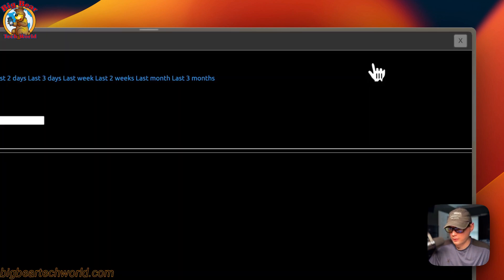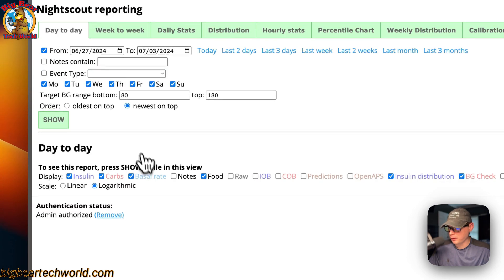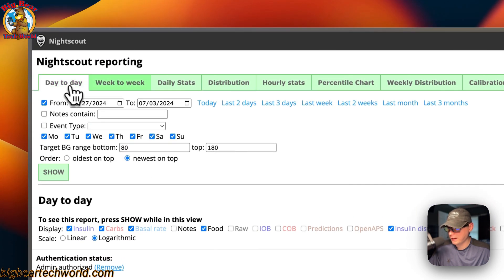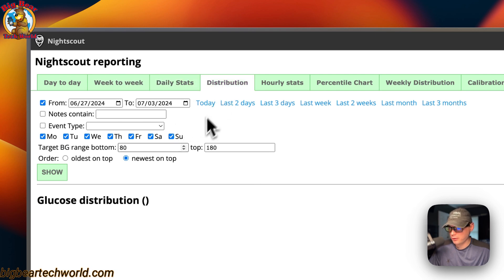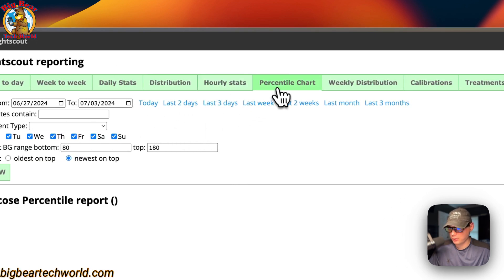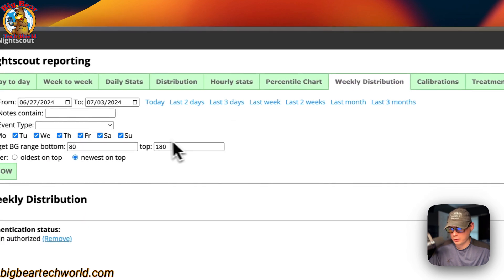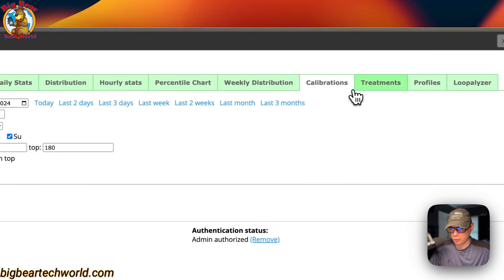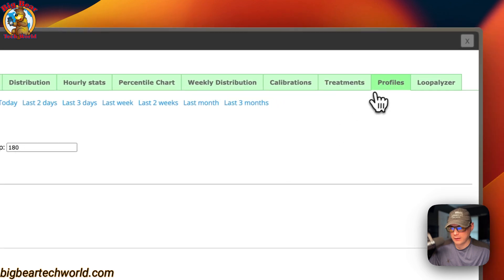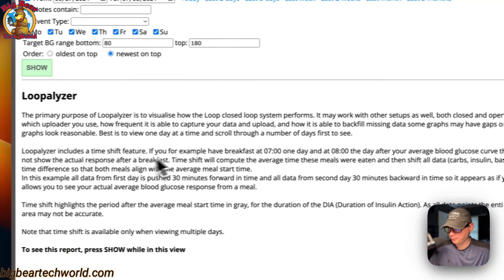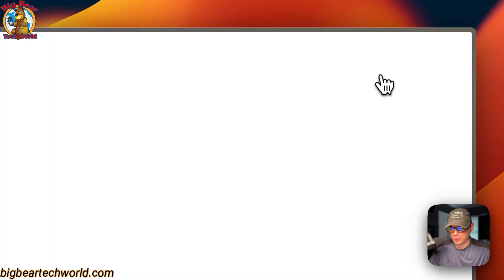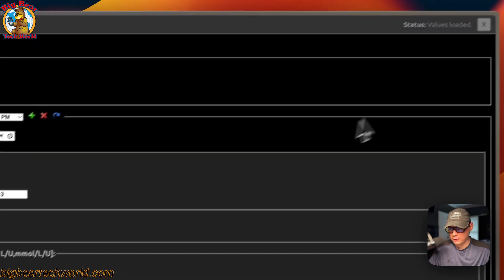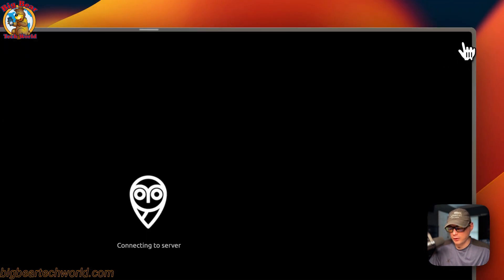In Reports you can see: Day to Day, Week to Week, Daily Stats, Distribution, Hourly Stats, Percentile Chart, Weekly Distribution, Calibrations, Treatments, Profiles, and a Loopalyzer. You can go back to the home screen by clicking X, then go to Profile Editor and you're back on that starting screen.